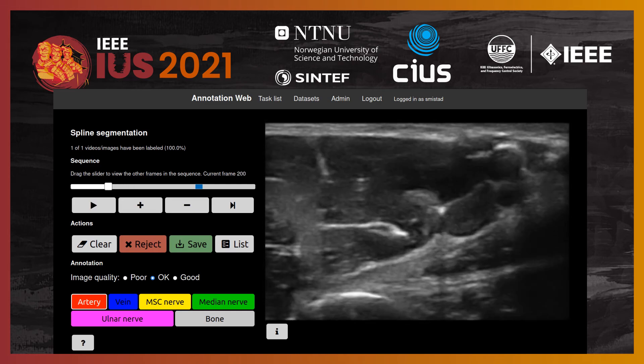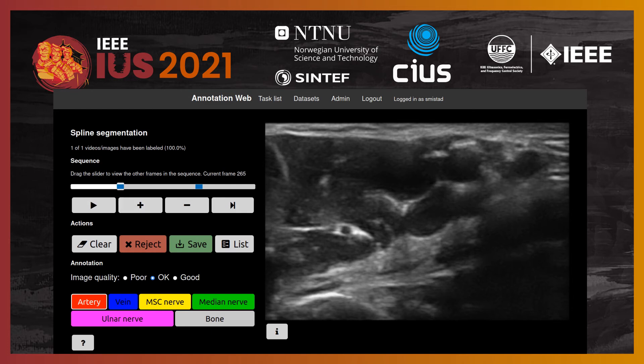This is the spline segmentation tool, which allows you to set control points which form a spline to delineate a structure.